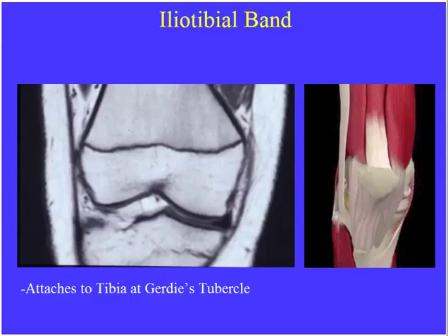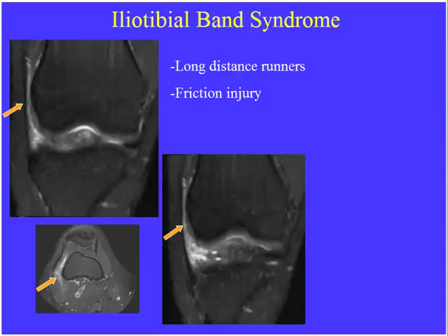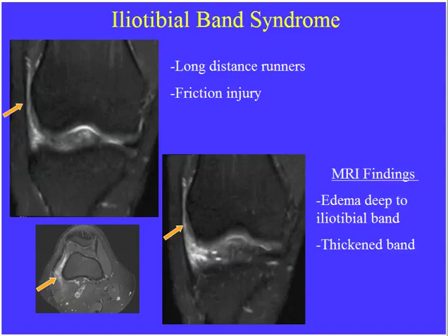Iliotibial band syndrome: the IT band comes down laterally and inserts on Gerdy's tubercle. On MR they show edema deep to the iliotibial band, visible on coronal and axial planes — an IT band friction syndrome occurring in long-distance runners. There may also be reactive marrow edema within the adjacent lateral femoral condyle.